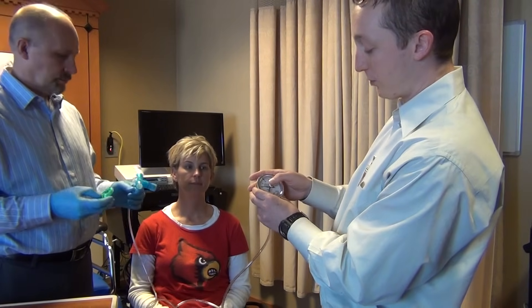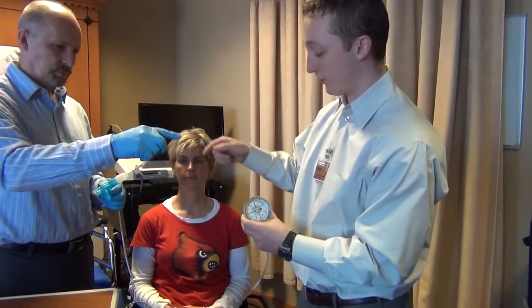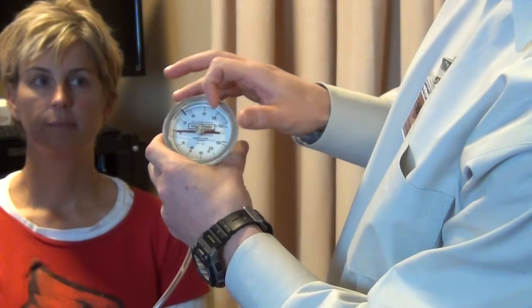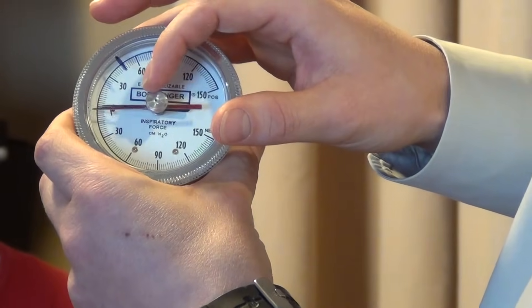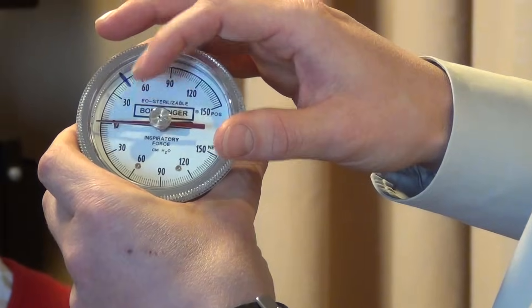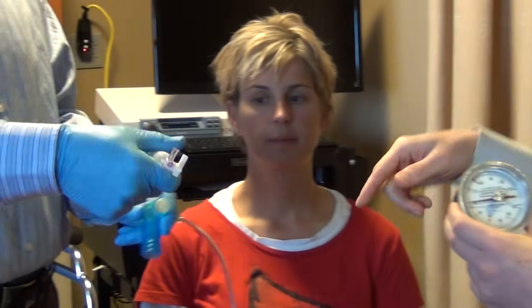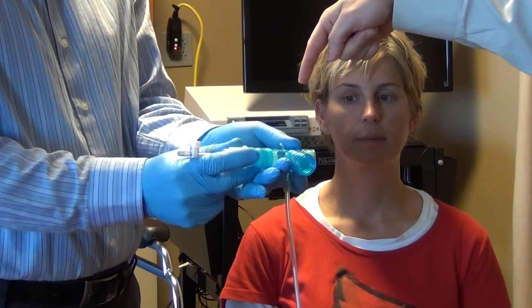For the inspiratory pressure test, you're going to put the red reference needle below the black needle. Because the pressure is negative, it's going to go in the opposite direction. So then we have to take the mouthpiece and put it on the other side so that it offers inspiratory resistance.